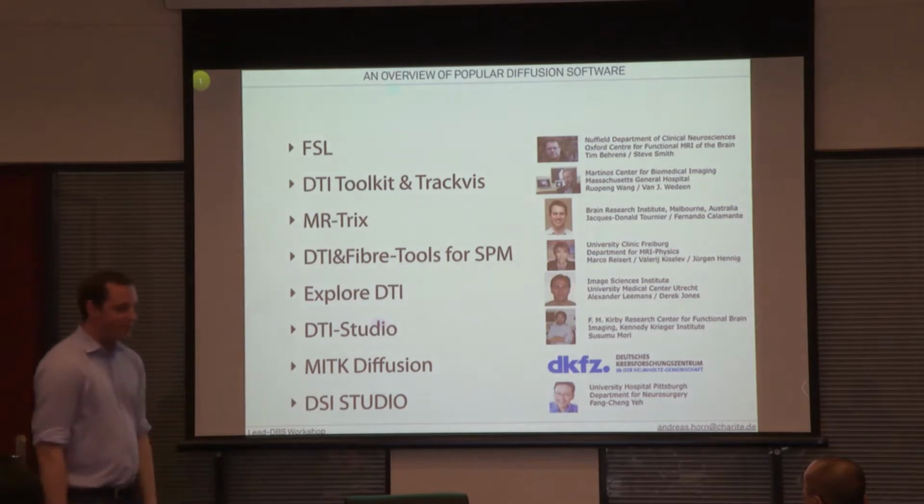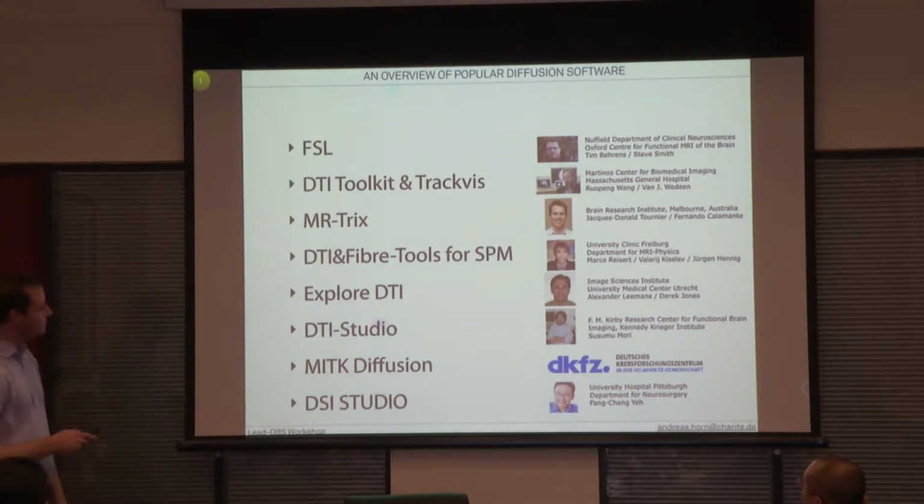But that's just one option. So there are tons of software tools. I think most popular is FSL, which they really say probabilistic tractography is great, and they have a BedpostX model, and I think there's a lot of documentation out there to use FSL. So it's a very common tool. Then there's the DTI toolkit and TrackVis from Harvard, from the Martinos Center. I think they had this one controversial but very influential science publication with orthogonal tracts and so on, and the TrackVis software is really nice for visualization. So you can use Lead-DBS to export to TrackVis format as well.